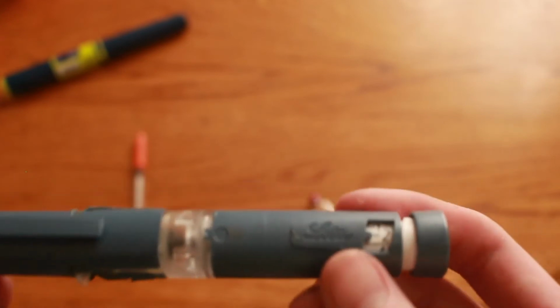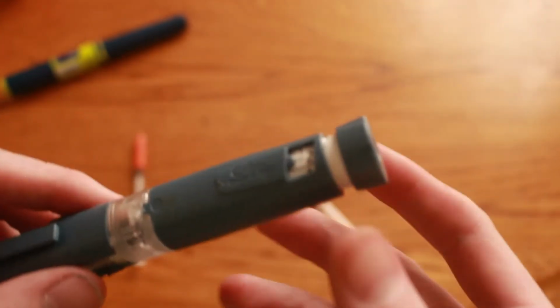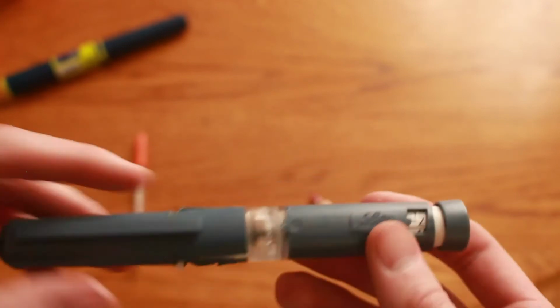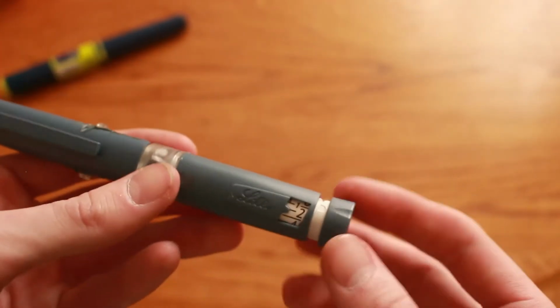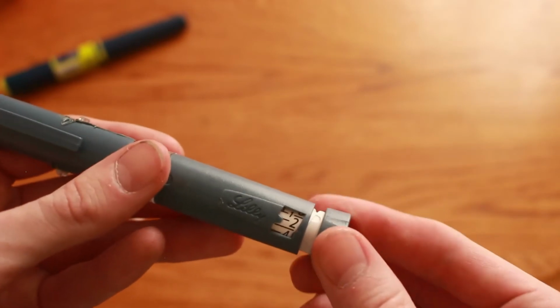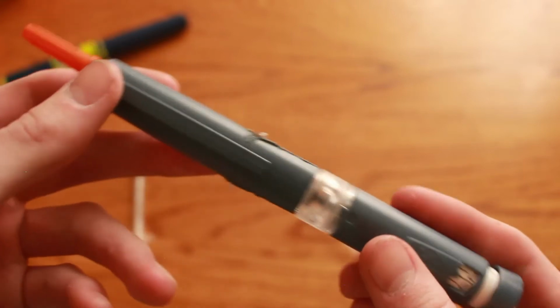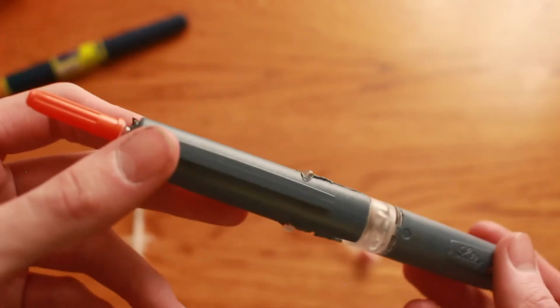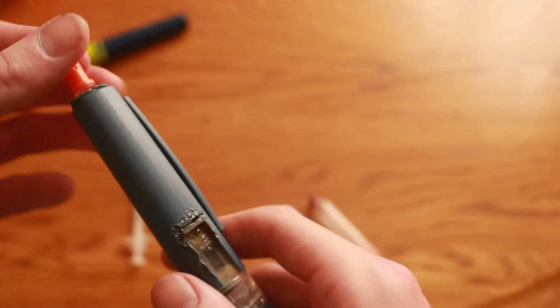This is a level of precision that you simply cannot get without diluting your insulin. The only way you can get it is diluting your insulin. So short of that, the only way to get a number as precise as 0.1, 0.2, 0.3 units, consistently, mind you, is with this new invention I've made. I'm really proud of it. Let me just show you how it works here.